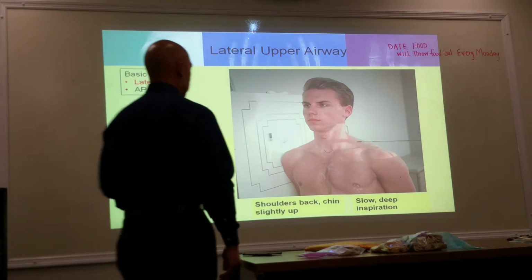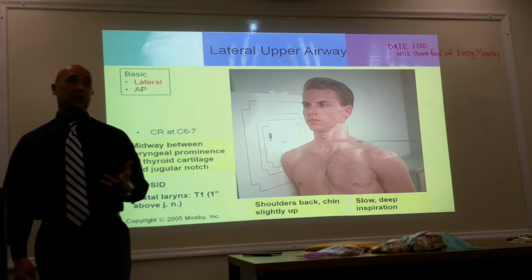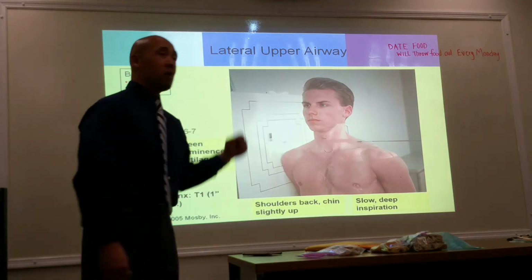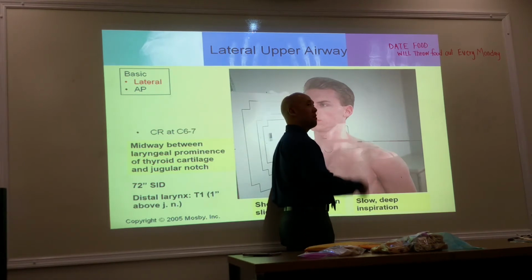But how do I know if they're doing it correctly? Here's the trick of my trade. When I used to do upper airway, shoulders slightly back, chin up, I would have them hum.